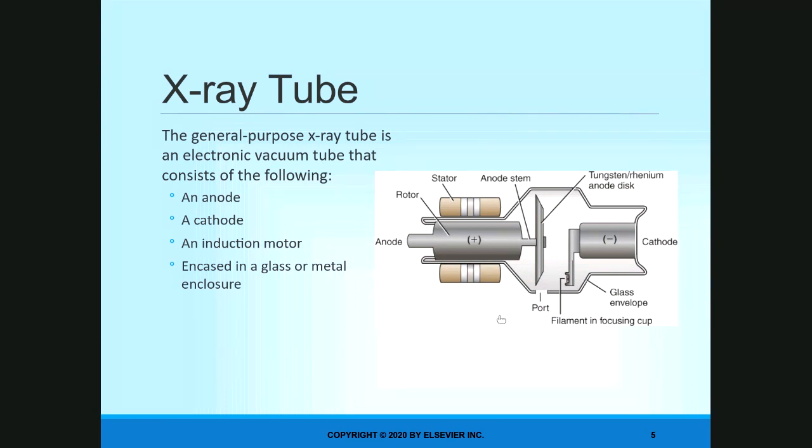And that can lead to arcing and damage of the tube, because then you end up with little pieces of metal down here, pieces of the filament, and the electrons actually come from the cathode down to the metal, and they kind of spark. And if that spark creates an arc, then this whole thing would actually implode. So that is a problem with the glass enclosures.